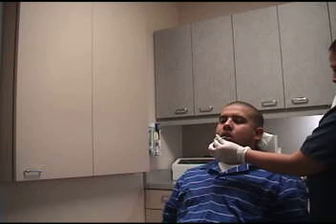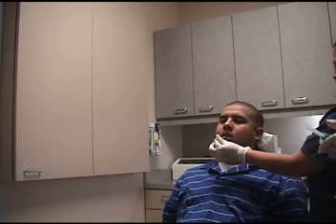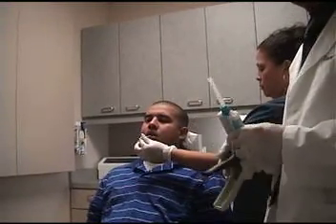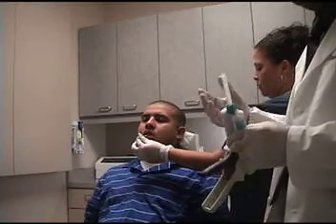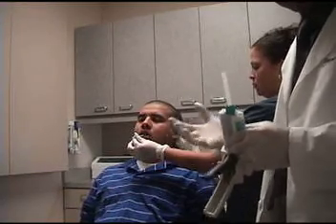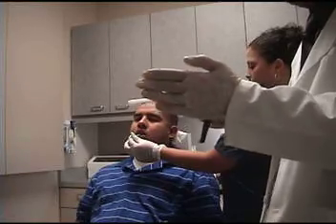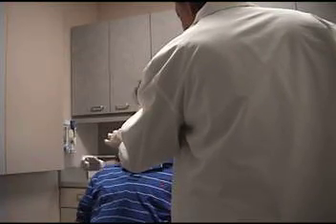Now, with this patient, because his diagnosis in his situation is capsulitis, I'm picking the 69 position. If this person had discal ligament problems, elongation, popping, clicking, dislocation of the disc in the supine position, then I would actually pick the 66 position to give the optimal range of that phonetic position. You see, each of these numbers in this S position gives you a slight variance. Okay? Now we're going to hold that position, nobody move, you're doing great, terrific.